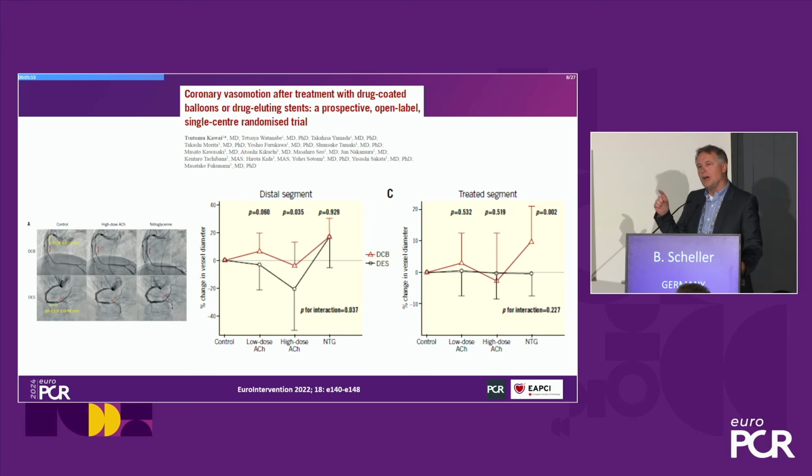What we gain is vasomotion, which I think is very important, because if we talk about differences in angiographic outcomes between stents and DCB, we have to be aware that the stent diameter is fixed. It cannot adapt to the flow that is needed in this typical situation. And therefore, a lower MLD in DCB does not mean that in the DCB-treated area under exercise there is no better flow. That's another thing we have to be aware of when we discuss the results of mechanistic trials.